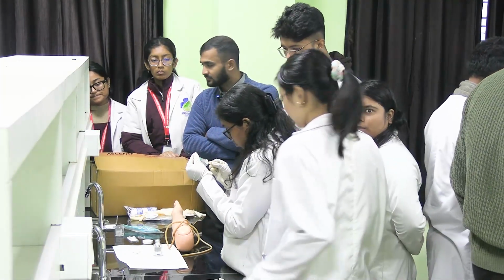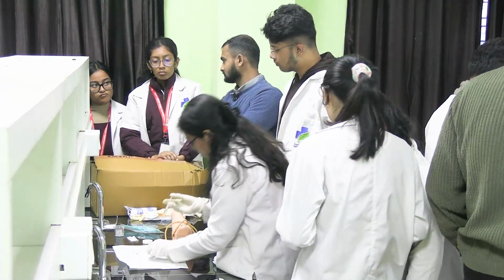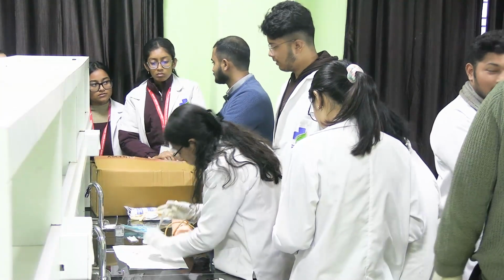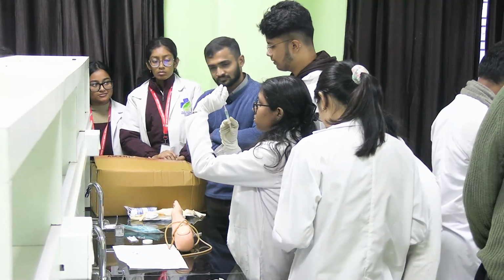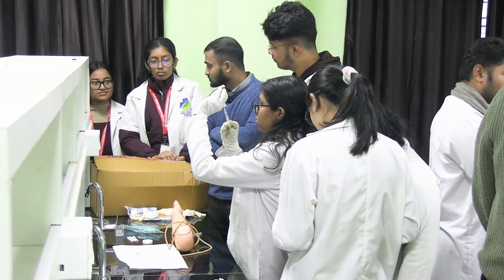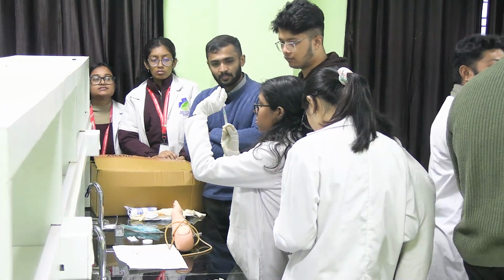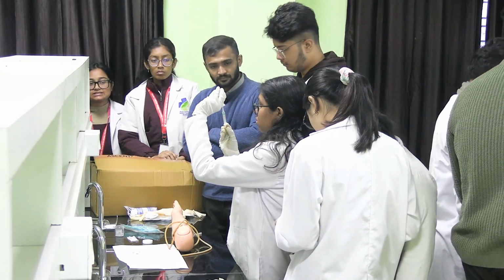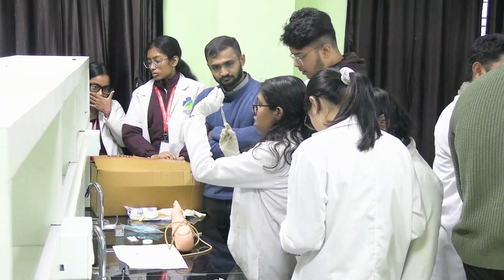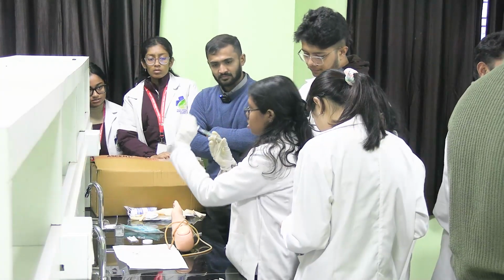What should be the size of the syringe when you take from the vial? If you are taking 1 ml, it should be twice, so it should be a 2 ml syringe. So in this process, I'll take 1.1 ml in subcutaneous. The same amount to be introduced.